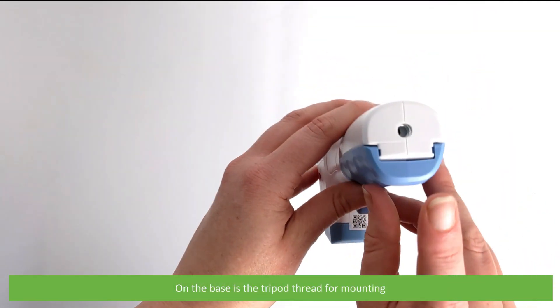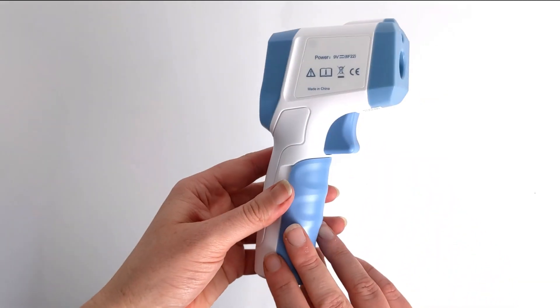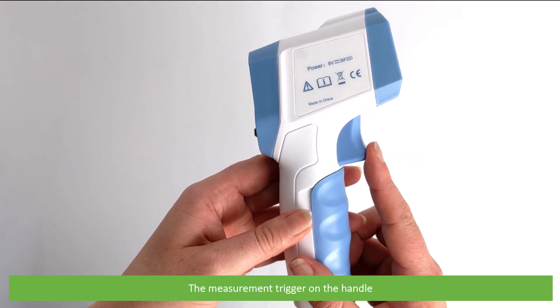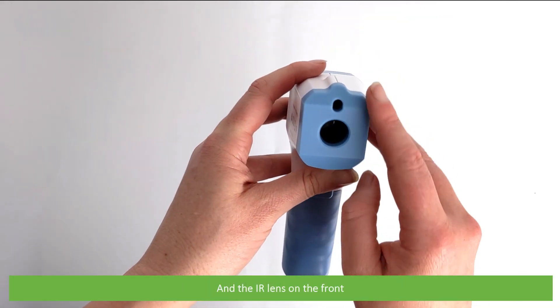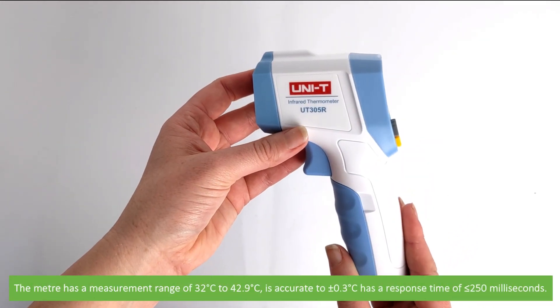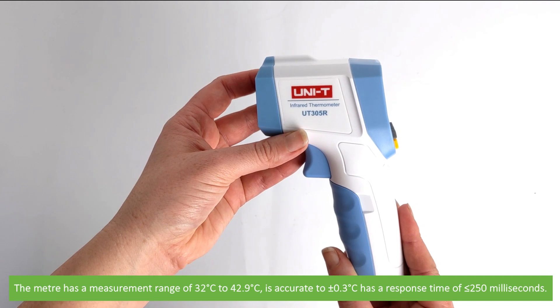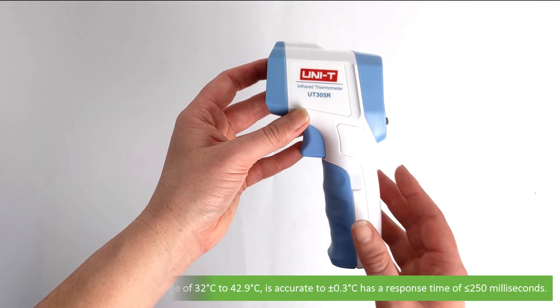On the base is a tripod thread for mounting, the measurement trigger is on the handle, and the IR lens is on the front. The meter has a measurement range of 32 to 42.9 degrees, is accurate to plus or minus 0.3, and has a response time of less than 250 milliseconds.